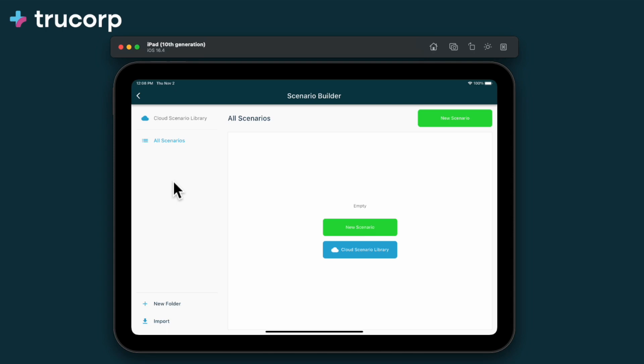Scenario Builder allows you to build scenarios in advance of your sessions, saving you time and allowing you to create complicated simulations.